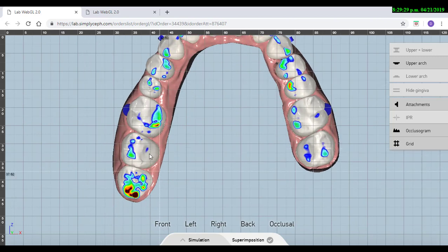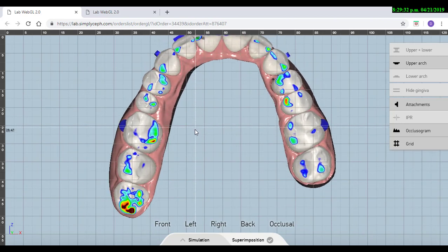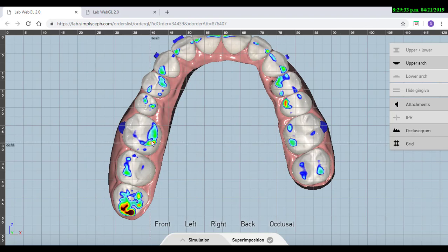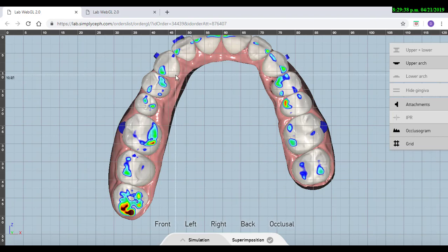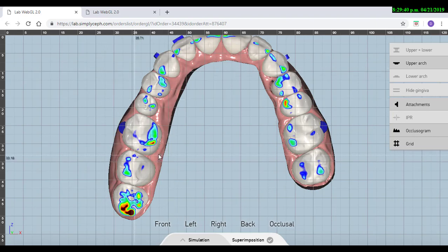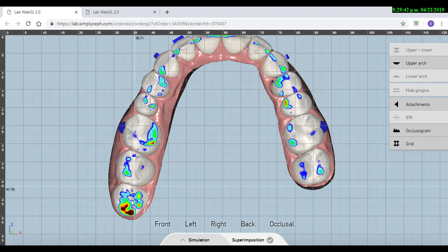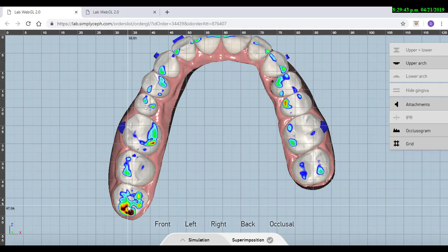For example, in here I see that this second molar has a heavy occlusal contact, and also this molar and this premolar, so I have two options: either to tell the technician to leave heavy occlusal contacts in all posterior teeth, or to make these heavy occlusal contacts disappear.